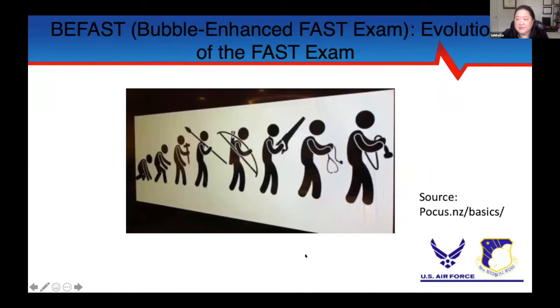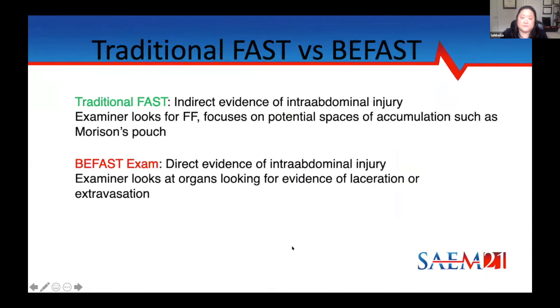So recently I was awarded funding from the DoD for my BFAST study, Bubble Enhanced FAST exam. With this project, I'm looking at hemodynamically stable blunt abdominal trauma. Although there have been studies in Europe with contrast enhanced ultrasound agents and blunt abdominal trauma, they've mostly been in radiology suites, and this one is at the point of care. So we're comparing traditional FAST to BFAST.